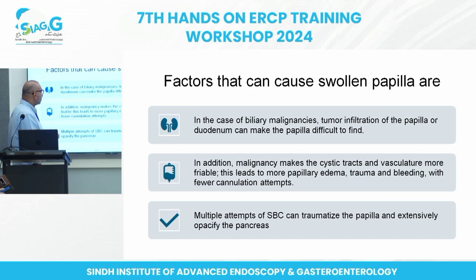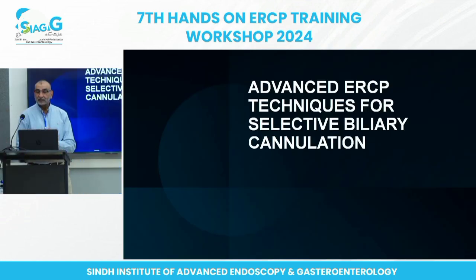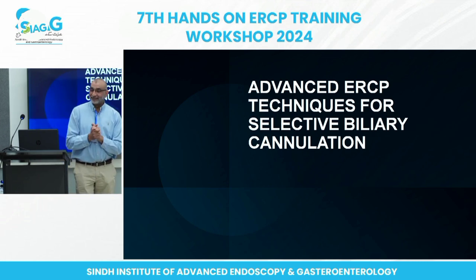Obviously, different conditions जो हैं, like if you got pancreatitis, you got other conditions which will make it swollen and difficult too. Or secondly, sometimes you do it yourself. बार-बार आप उसको probe करते हैं तो उससे it becomes swollen and damaged, and that makes life more difficult for you. हाँ जी, खेल खत्म। Any questions?